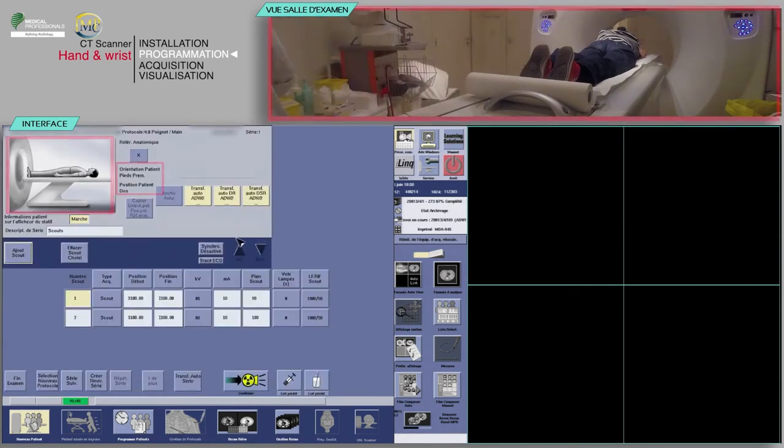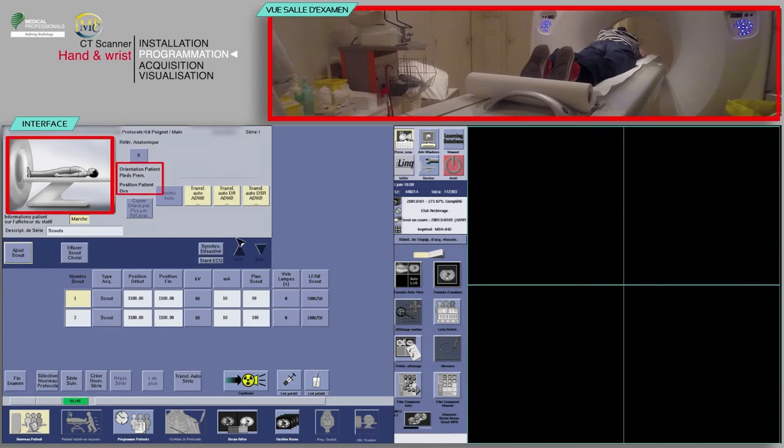Important note: for this exam the patient position on the monitor does not match the patient position on the table, allowing the radiologist to interpret the reconstructed images in the reference position. The patient may be head first on your table; however, the wrist will proceed through the scanner feet first.